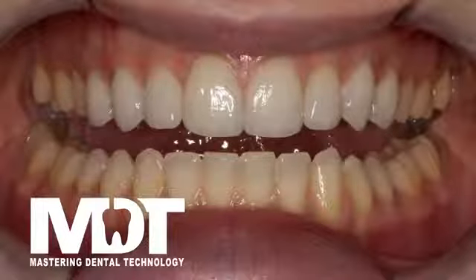But we're not somehow respecting the opacity level of a crown and the underlying stump when we're dealing with full porcelain crowns, whether they are made out of a lithium silicate material or a full zirconia crown material. The underlying stump is crucial, because I'm sure we've all seen it that we do a beautiful crown that looks great on the model, and then when it comes to cementation, the value drops. So the information about the right stump shade and how it reflects onto the material we're working with is extremely important.